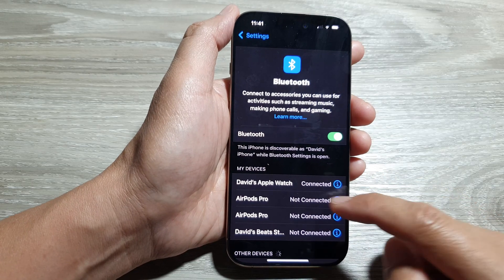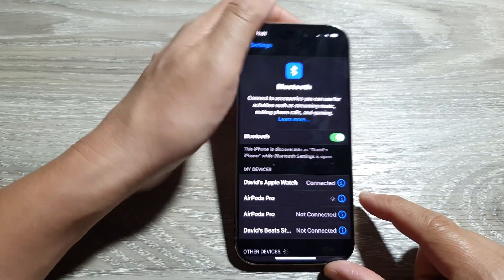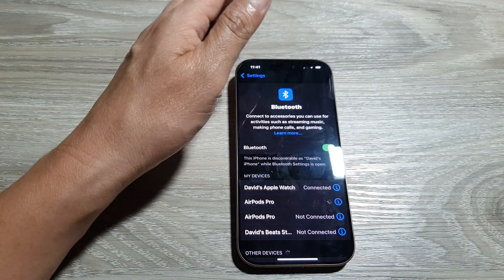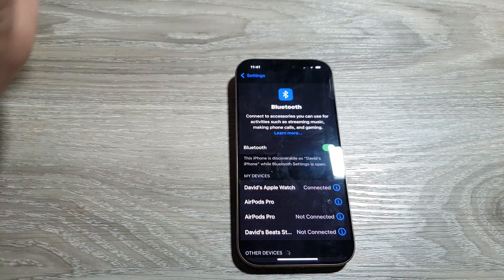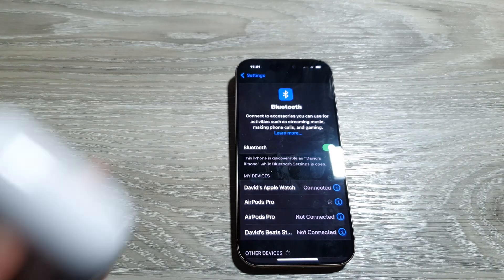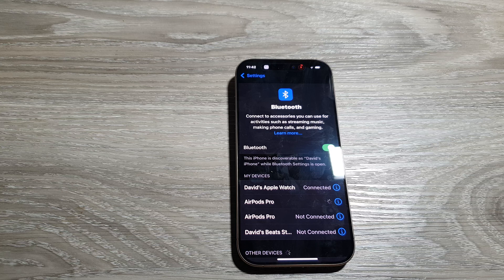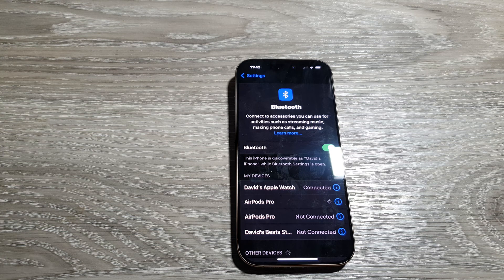Here the AirPods are not connected at the moment. Make sure they are connected, and also make sure your AirPods or earphones are fully charged and have power. Then simply place them in your ear and wear them.